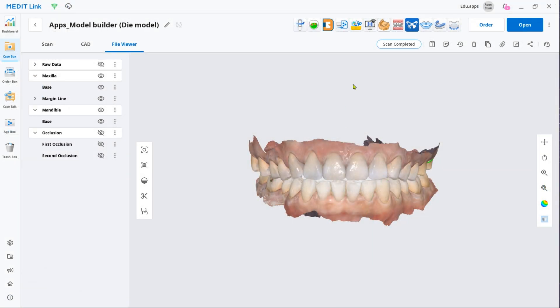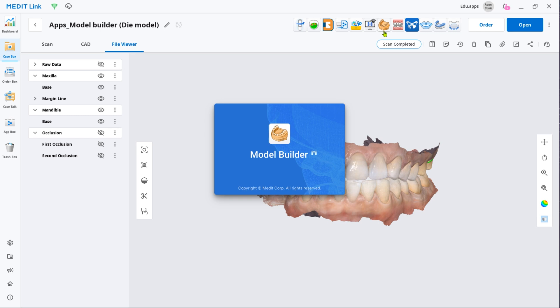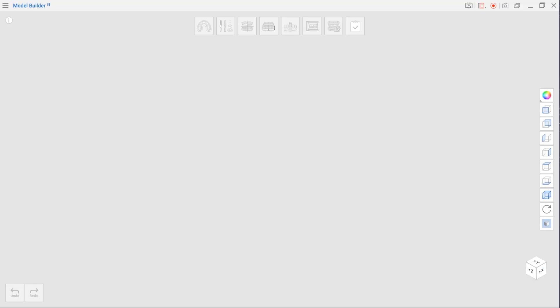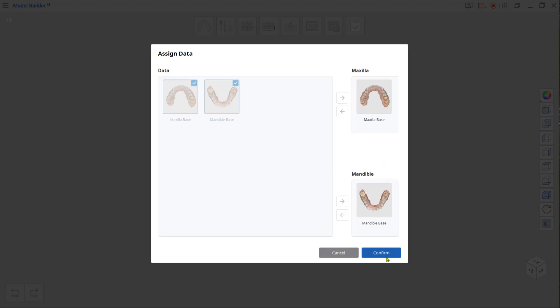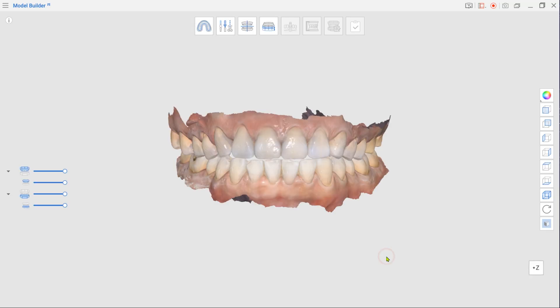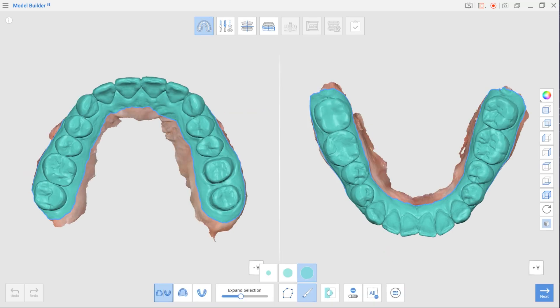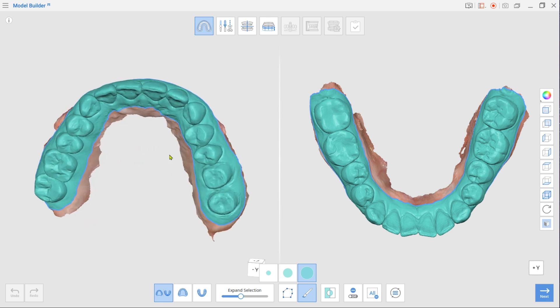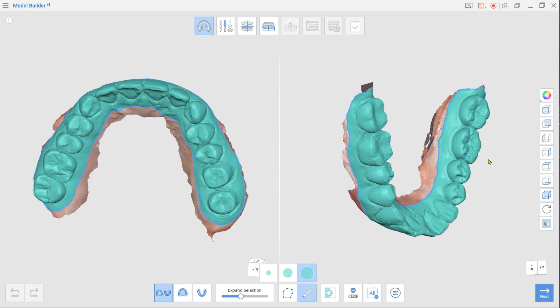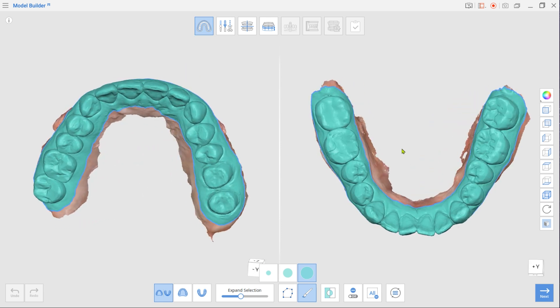After scanning, open Model Builder by clicking the app icon at the top. Your scan data will be automatically assigned as maxilla and mandible. First, enter Area Designation mode. Enlarge selected areas using the Expand Selection slider. Left-out parts can be selected with brush selection.